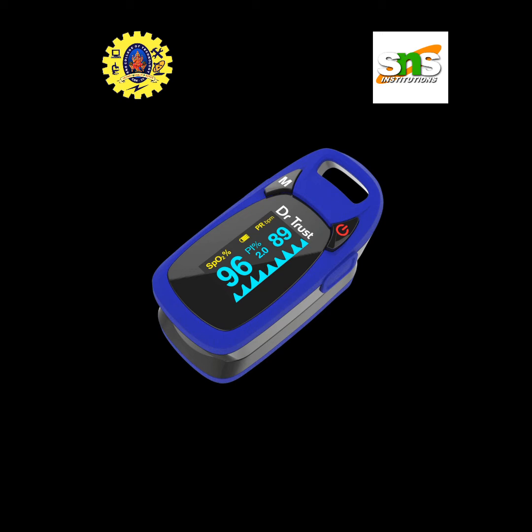Part of the light will be absorbed by the finger and the part not absorbed reaches the light detector. The pulse oximeter uses the property that oxyhemoglobin and deoxyhemoglobin absorb light of different wavelengths in a specific way. Oxyhemoglobin and deoxyhemoglobin absorb different amounts of light at different wavelengths.